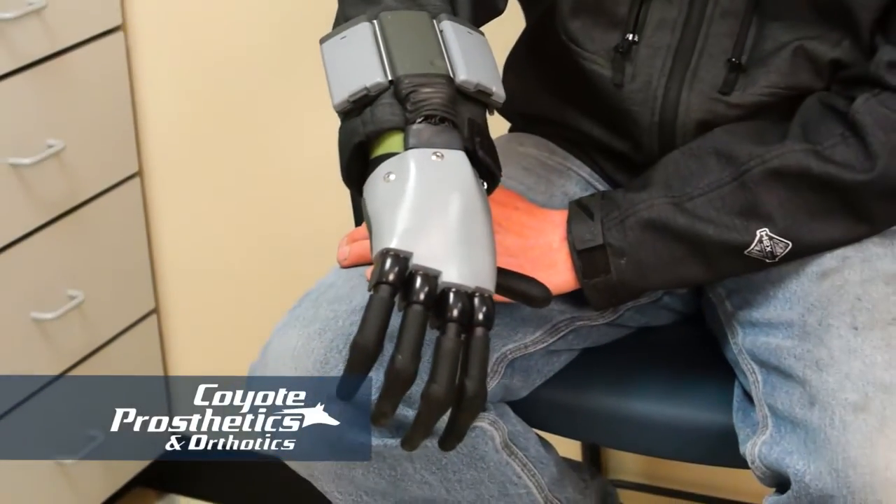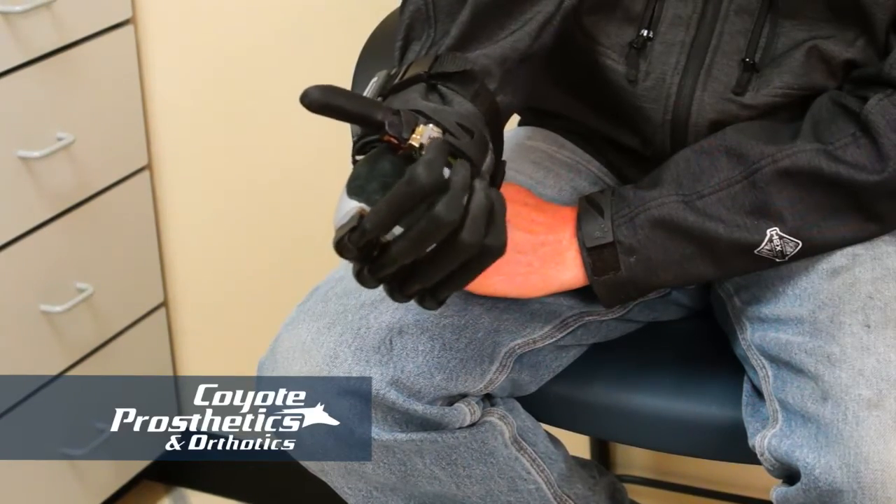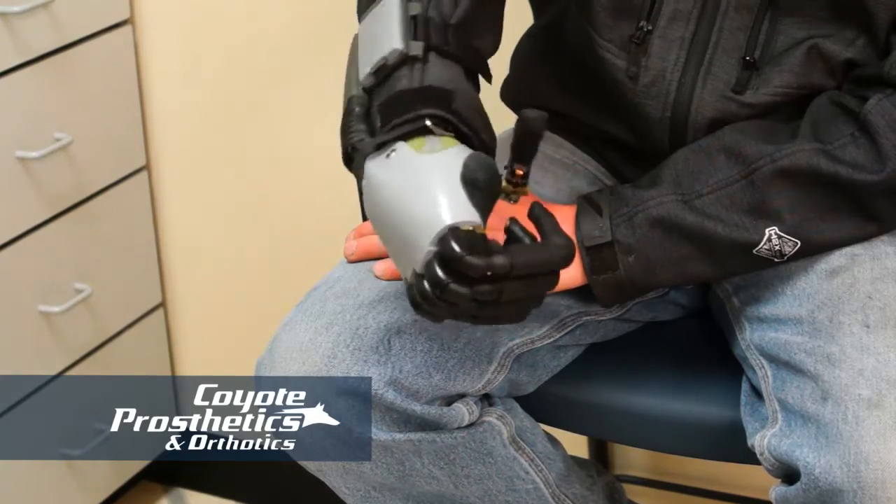For the most part, we've been able to keep it very comfortable. Whenever I have issues, we make changes right away. I bring it right over and these guys make the changes we need to make and get me going. They've been great. I've never had any problems with them. Anytime I've called and needed any kind of repairs, they get me in, get me repaired or make the changes that need to be changed, and I'm back up and running.